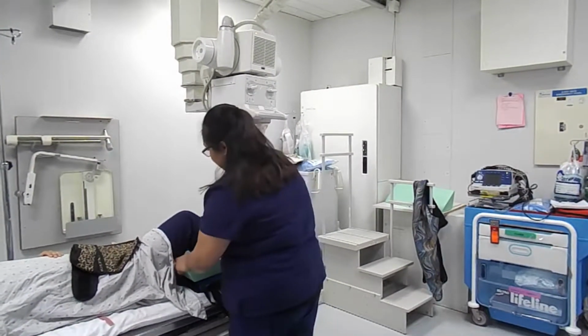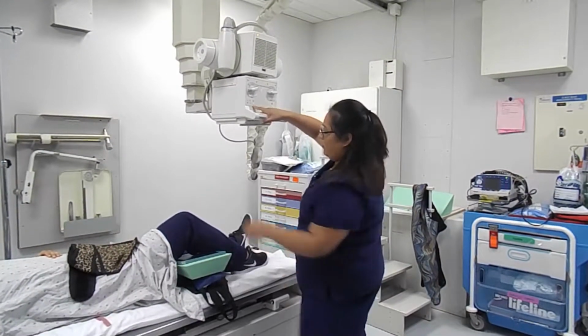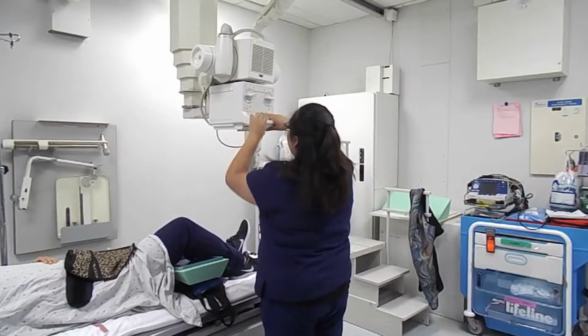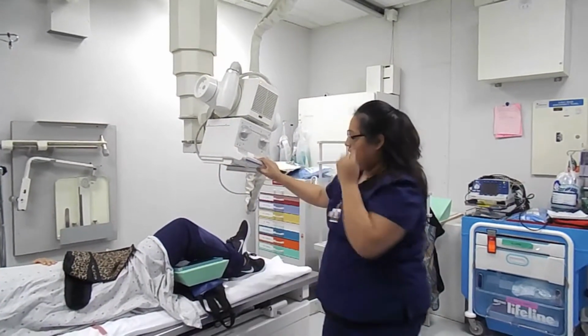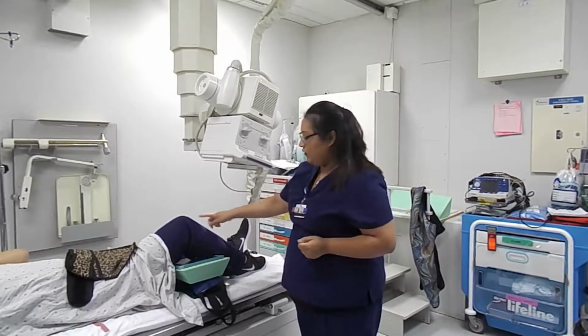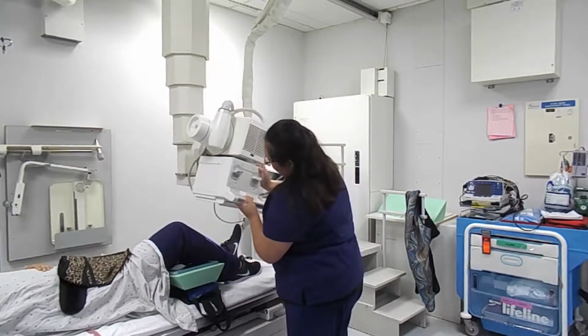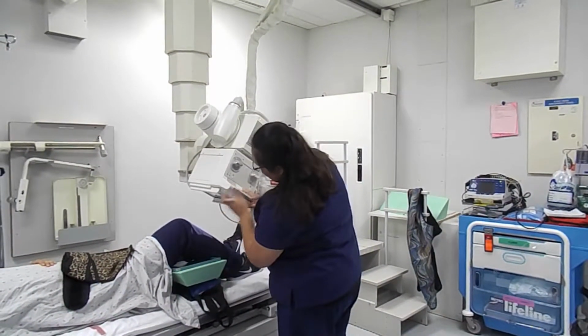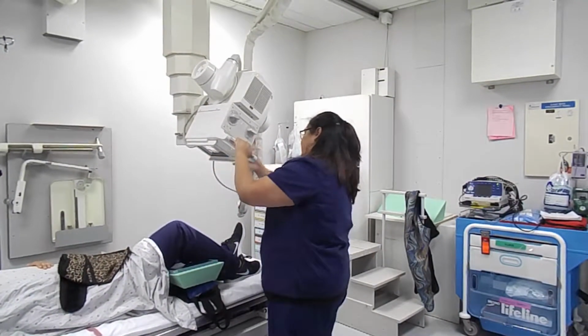Doing okay, Miss Garcia? Now for center ray, our image actually requires a center ray to be perpendicular to the long axis of the lower leg here. So keeping our SID of 40.